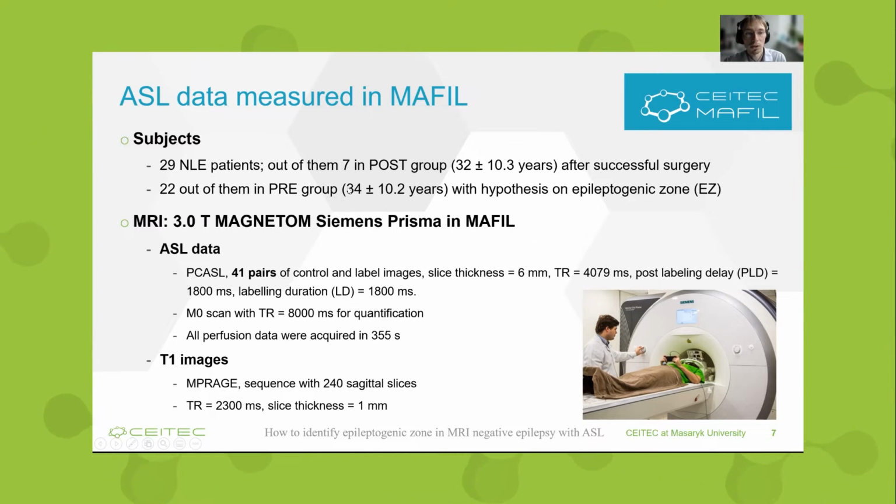Our aim was to use this ASL data to identify the epileptogenic zone. In the post-operative group, we had a resection mask for verification purposes. In the preoperative group, we had a mask of hypothesis, which was bigger, but also we could use it for verification.